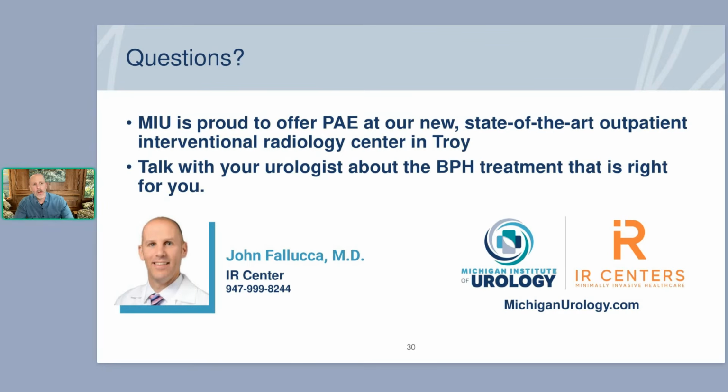Question about already having had aquablation therapy and results didn't change anything. Is this worthwhile to try? And I think based on the previous slide, and again, back to the other patient that asked about the TURP, patients that have failed the transurethral therapies are good candidates for this. We can certainly attempt it. It's a minimally invasive option with extremely minimal side effects. So we can perform the procedure, and hopefully you will get benefit from it.